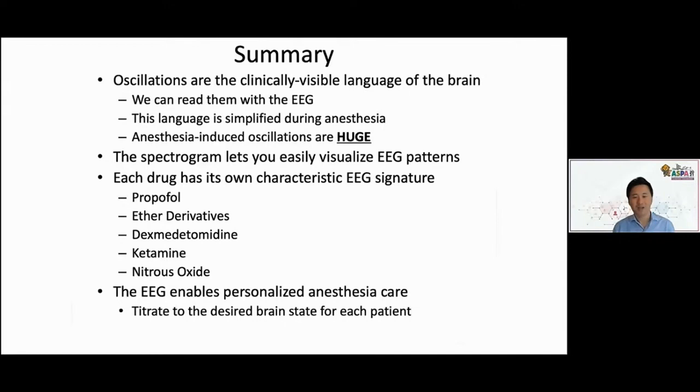And if we look at the EEG, we can actually use that information to titrate anesthetic requirements precisely for every individual patient. We're going to see a lot of that in case studies. Dr. Bong is going to be showing you some wonderful case studies that she's been working on, currently in review, to illustrate all the ways in which you can use this EEG to monitor your pediatric patients.